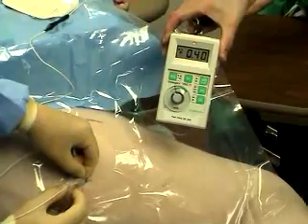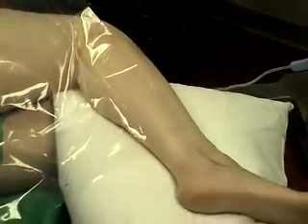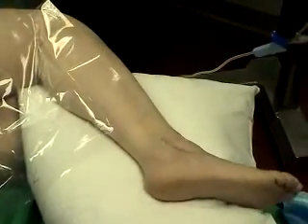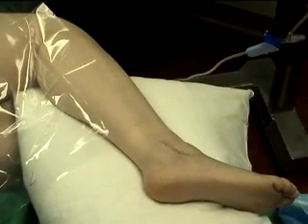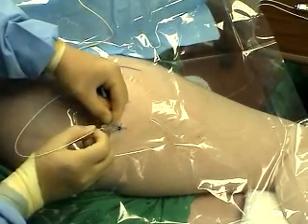In this recording, it can be seen that the catheter has been advanced for at least 5 centimeters along the sciatic nerve, and the foot twitches remained brisk at a nerve stimulator output of 0.4 milliamps. The needle is now removed without disturbing the catheter.